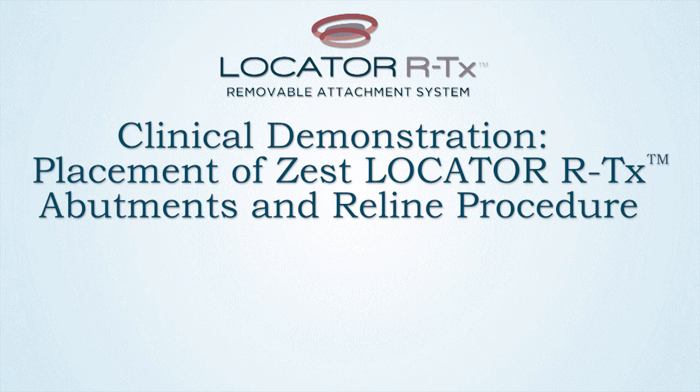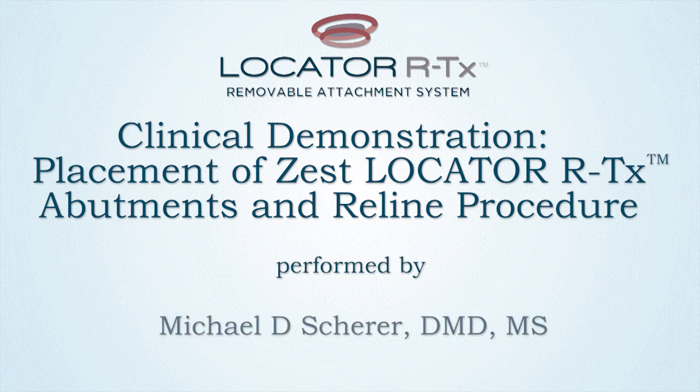This video demonstration has illustrated a clinical technique to remove healing abutments, place locator RTX abutments, and perform a laboratory reline procedure. Thank you for tuning in. This is Dr. Michael Shear with the Learn Locator.